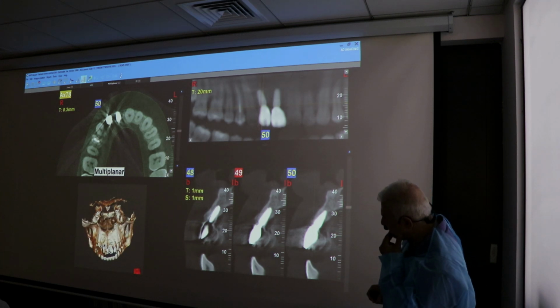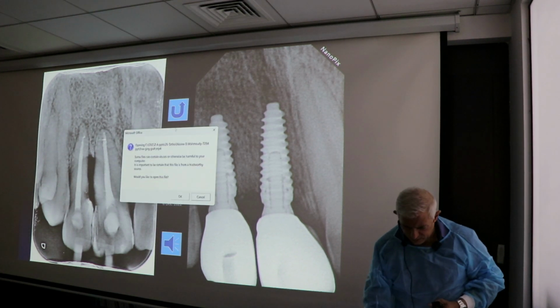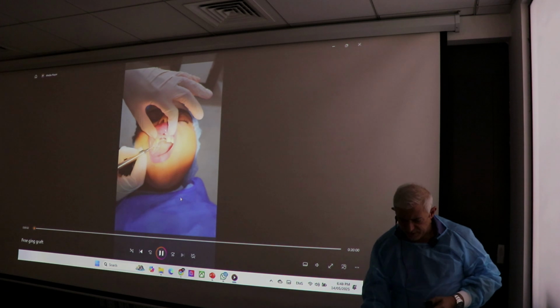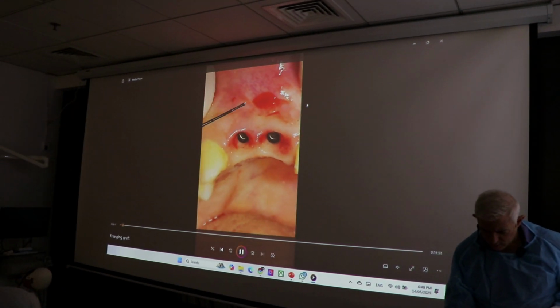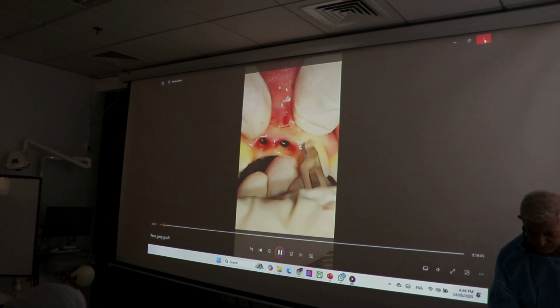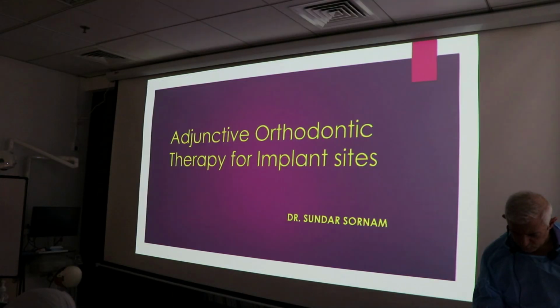So when we look at the CBCT, we'll talk about orthodontics. Then I will come back and show you what Nabil cannot wait to see, a 20-minute video of the soft tissue graft, to see how we tried to gain more soft tissue. Probably we could get more papilla. We'll do that later. So I'll ask my colleague, Dr. Sundar, to join me and continue this presentation.